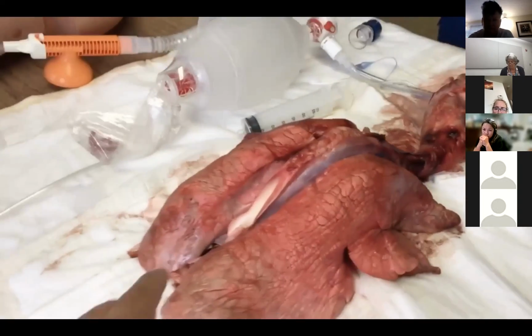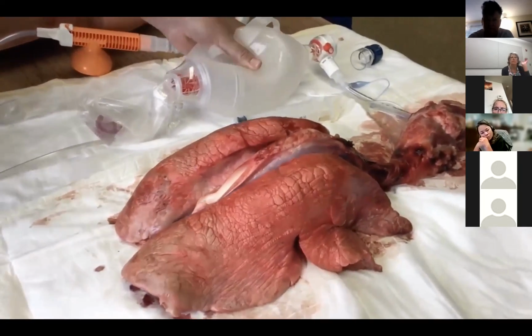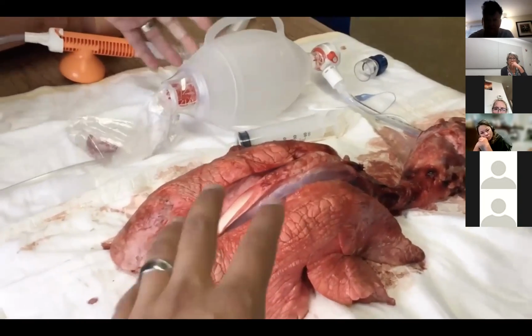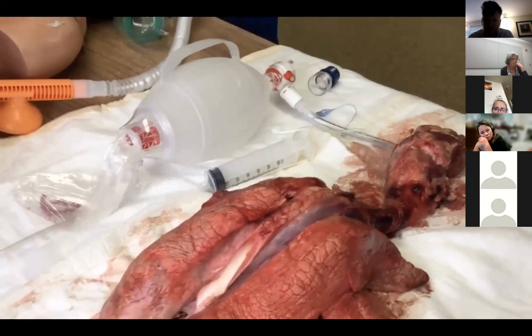So you got a patient and you're BVMing them and their sats are 80, their sats are 80. You throw that PEEP valve on, you keep that O2 in their lungs longer. And you're recruiting alveoli.